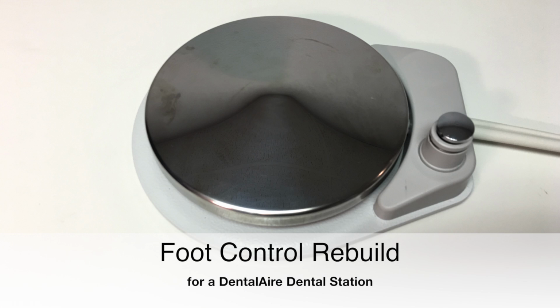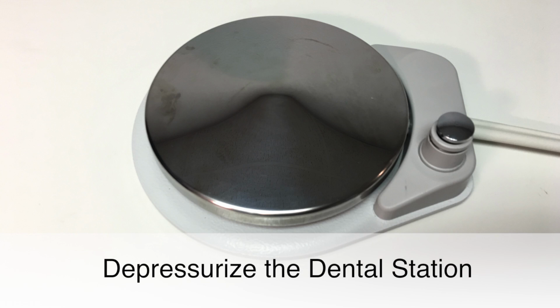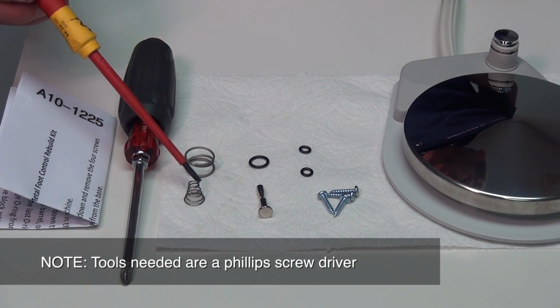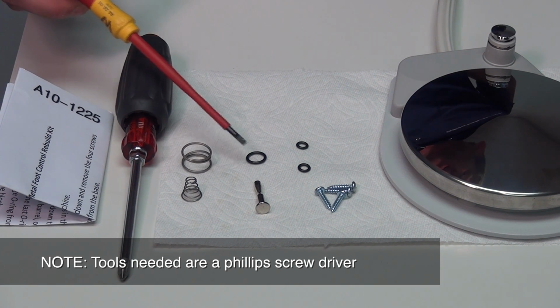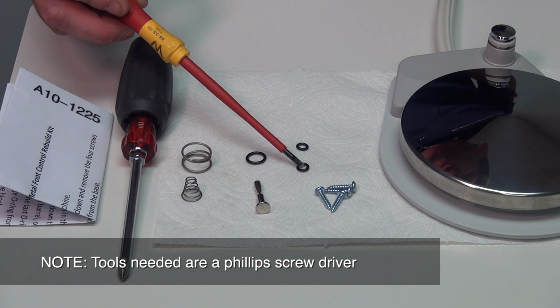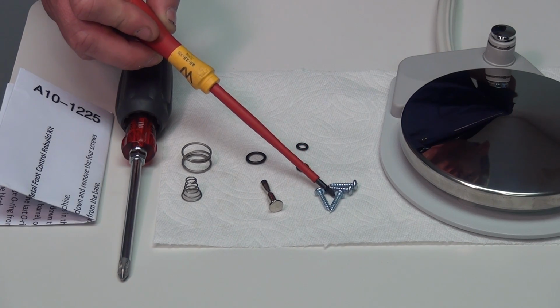Today I'm going to show you how to replace a foot control rebuild kit for a DentalAire dental station. First thing we want to do is depressurize the dental station to make sure there's no air pressure in the machine. The parts that are included are one small cone spring, one larger spring, one large black O-ring, two small black O-rings, one metal piston, 4 Phillips screws.